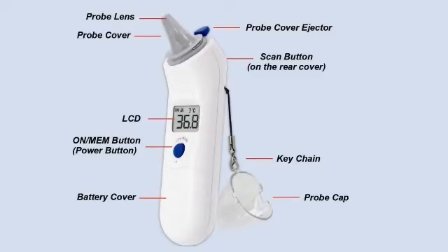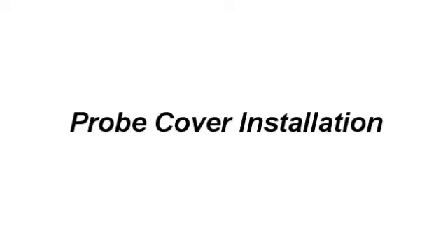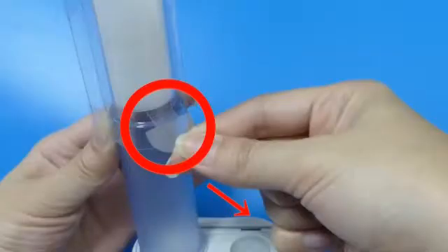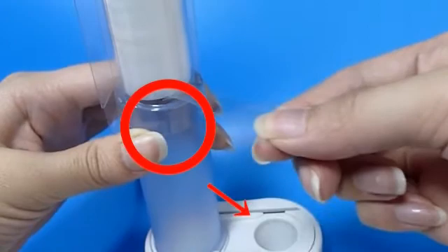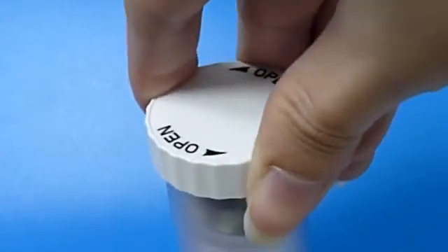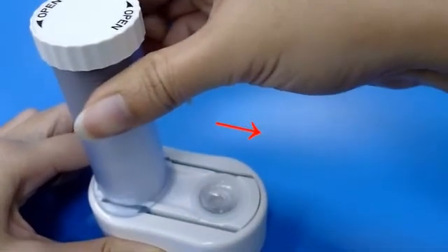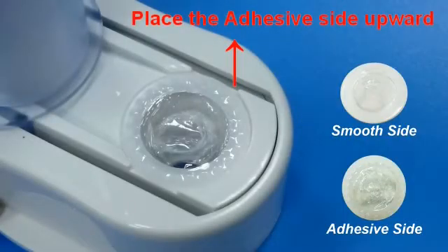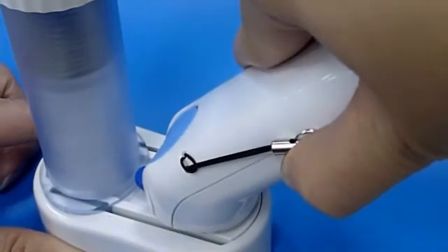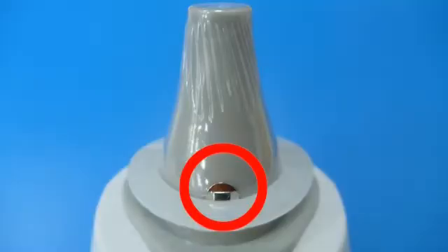Part name. To load probe covers: pull out the isolation sheet so the probe covers fall into the loader. Close the cap. Pull out the loader — once a new probe cover will automatically fall on the fixer. Align the probe with the center of the probe cover fixer, insert and push until you hear a click sound, which means the probe cover has been connected firmly.